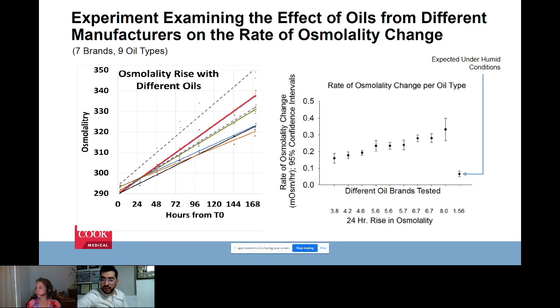Any suggestions on group culture or single embryo culture when using a dry incubator? Well, that's where I actually wouldn't be able to tell you, because there are a lot of papers saying that single culture is better and others saying that group culture is better. So it's not really related to a dry incubator. I think it's more related to the embryos per se. It's different from one author to the other. It basically says that even if you're using a dry incubator and doing a group culture, the amount of embryos in that droplet would not really affect the osmolarity, because that's not correlated at all. Yes, it's independent from that.